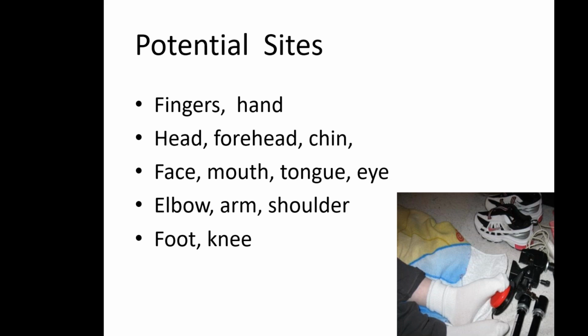So we're going to evaluate all of these potential sites and determine which one has the best consistency for that user. So we want them to be able to consistently hit that switch on a regular basis with the least amount of fatigue.